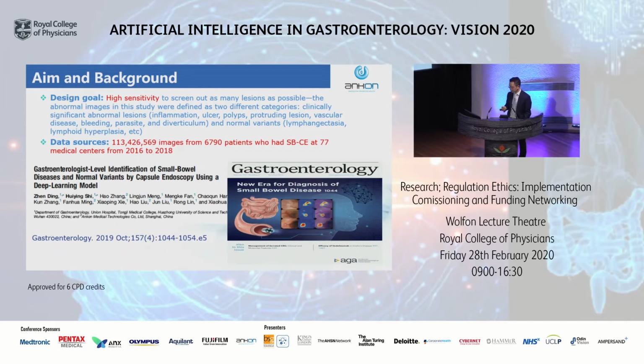The results were published last year, October, in Gastroenterology, as the cover page article. The comment from the editors says it opened a new era for diagnosis of small bowel disease.